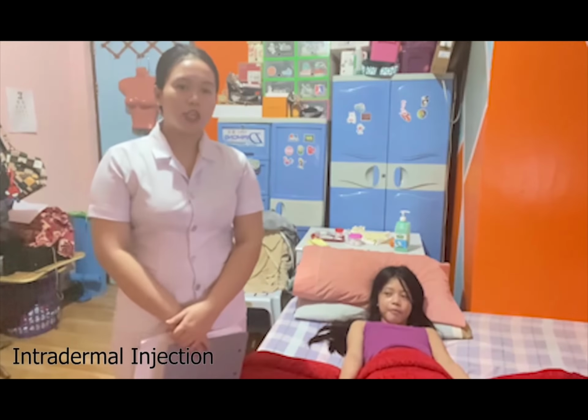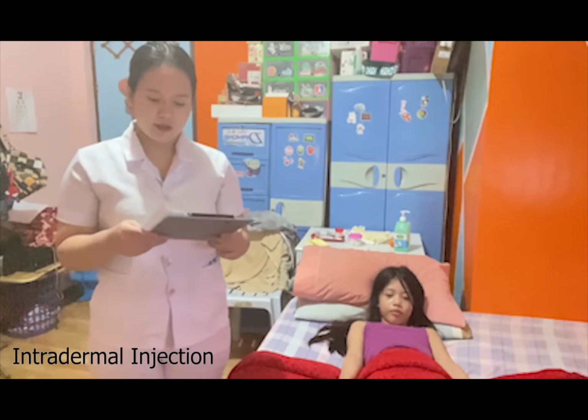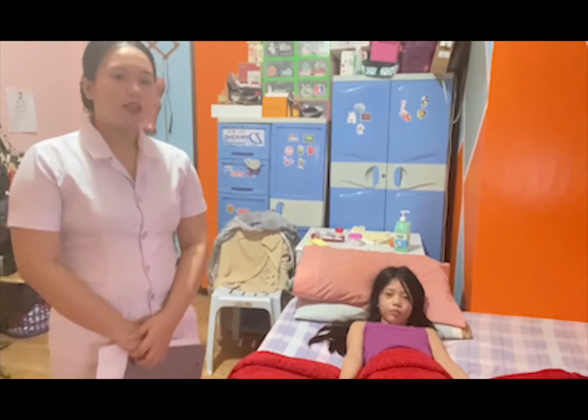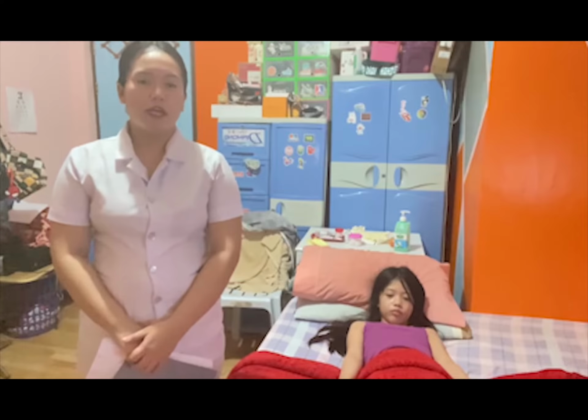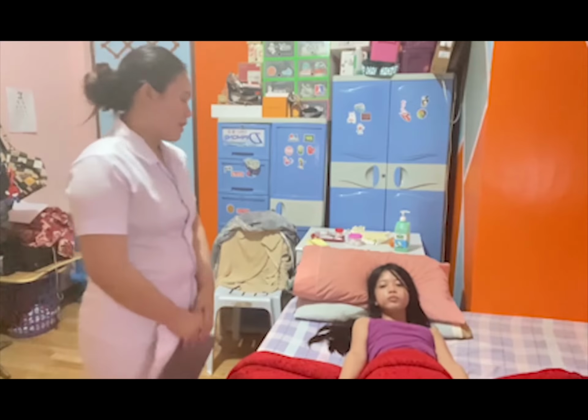So first, check the doctor's order on the patient's chart. Then, prior to performing the procedure, introduce yourself and verify the client, identify using agency protocol, and explain the procedure to the client. So, hello ma'am.